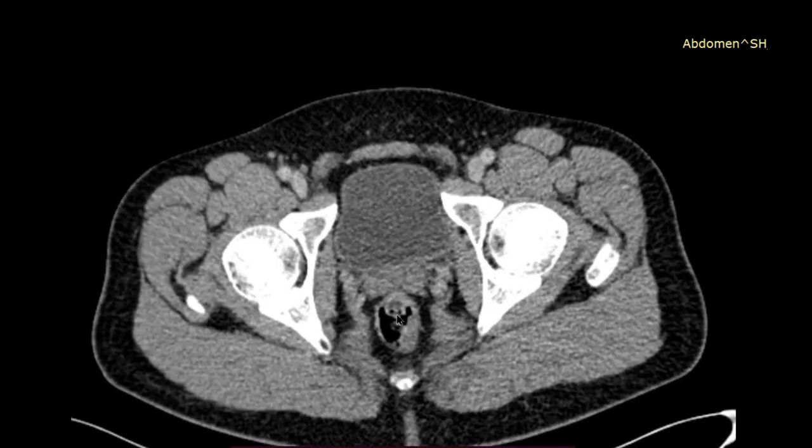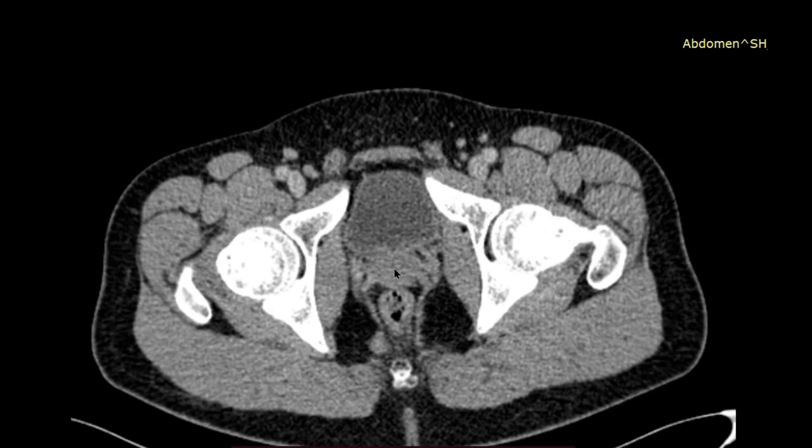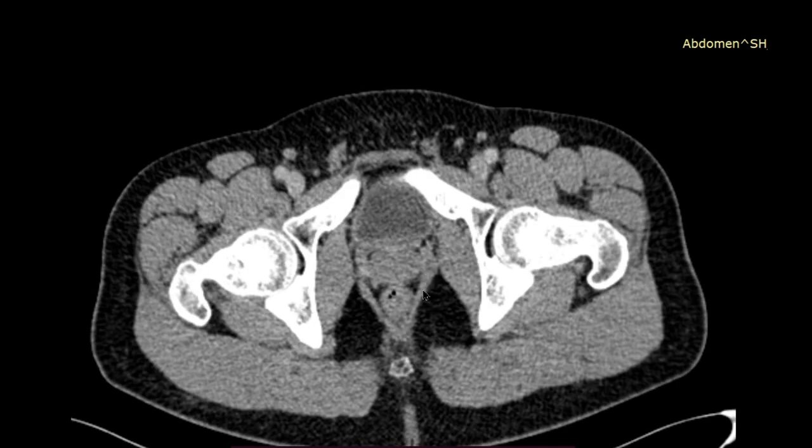And this is rectum. And this is urinary bladder, which is a fluid filled structure, urine filled structure, and on the inferior aspect this is prostate because it is a male patient. Otherwise, just behind the urinary bladder we would be finding uterus in a female patient. And this is the rectum, and surrounding the rectum this is puborectalis muscle, or simply you can just remember levator ani muscles, group of muscles, or pelvic floor muscles.